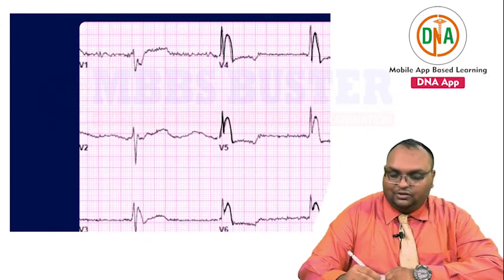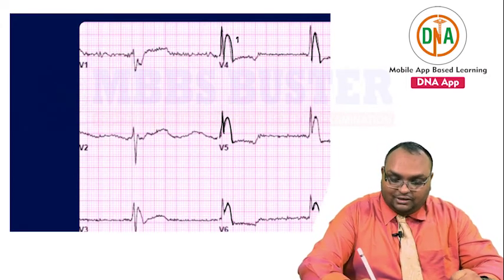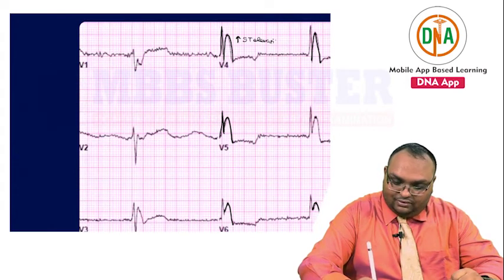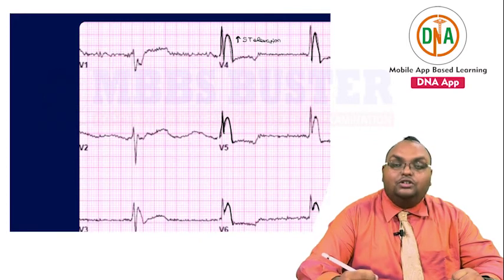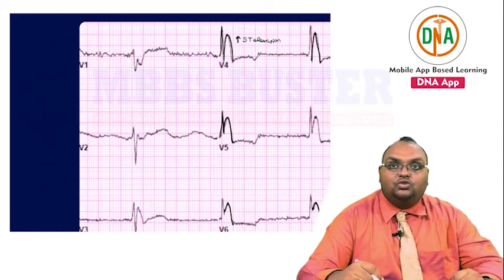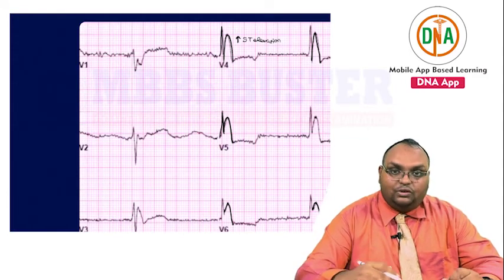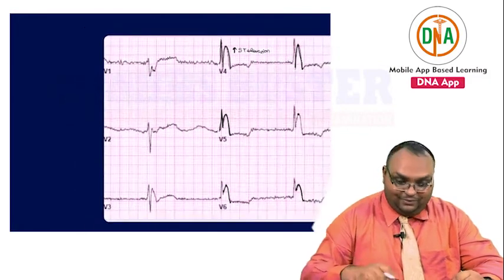After the R wave, you have this T wave, and as you can presumably understand, it is an ST elevation. It's a tall T, and of course you have a specific name for this sort of a pattern. It is associated with a particular condition which could lead to such a patient presenting in your ER, so you need to know that, right?